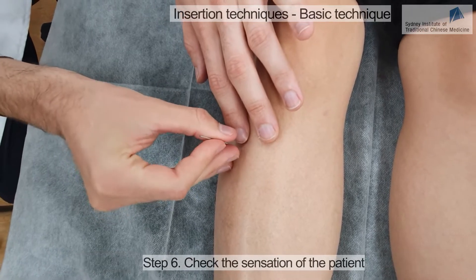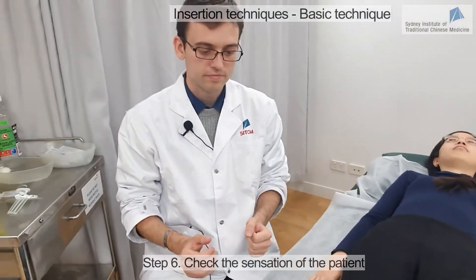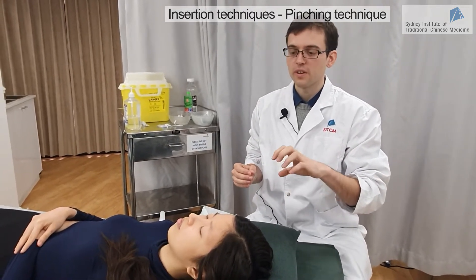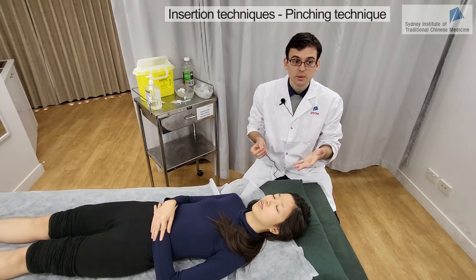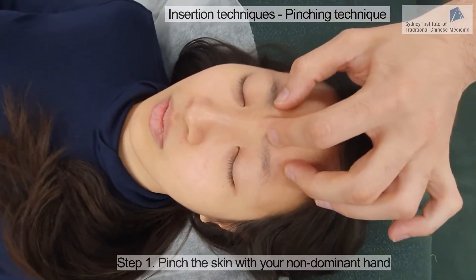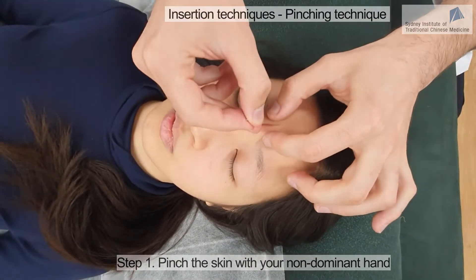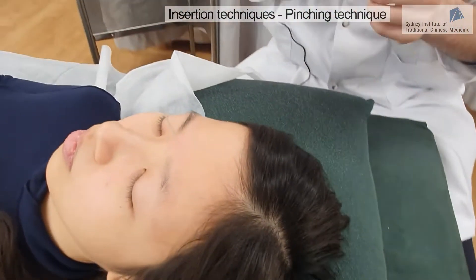How do you feel? I can feel some soreness. We're going to see now the pinching technique, which is very useful when there is not much flesh at the location of the point and you need to create more flesh in order to insert the needle. A good example is Yin Tang, right here in the forehead. Because the skin is very thin at this location, we pinch the skin this way, and then we have more space to needle with the other hand. You can see the needle can now stay in position on the point.